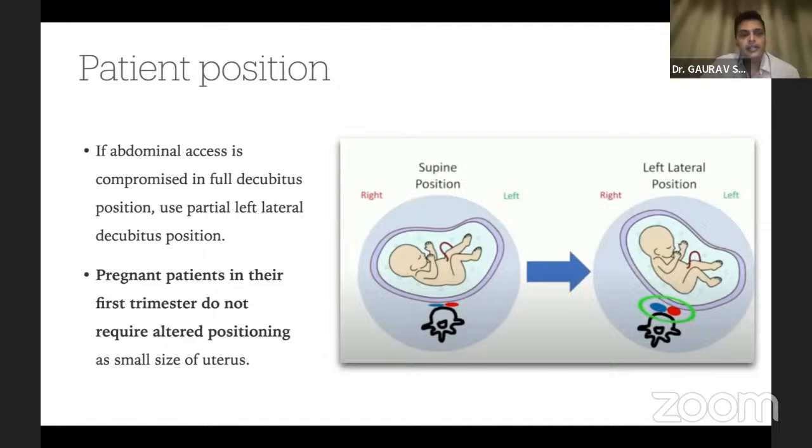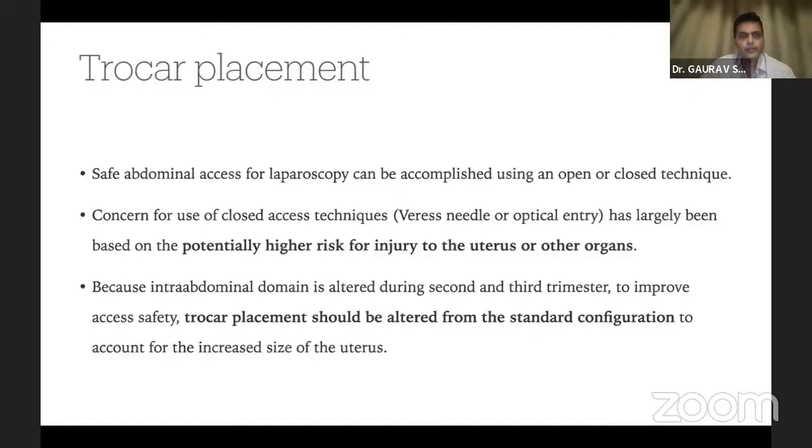And pregnant patients in their first trimester really don't require this because the uterus is fairly small and manageable in size. So where do I usually place the trocars? Let's come to trocar placement.